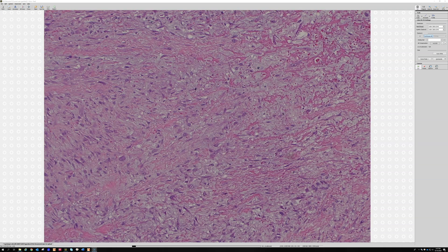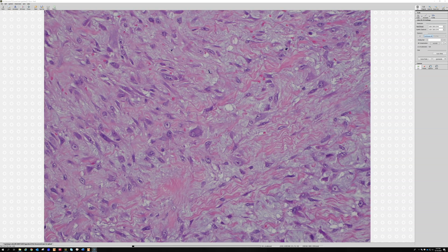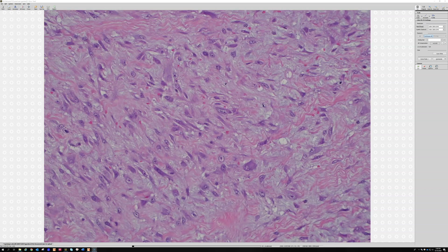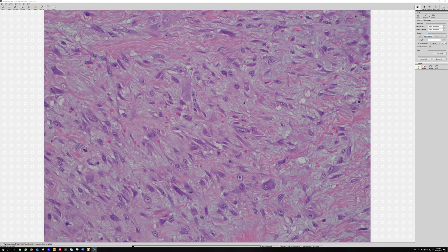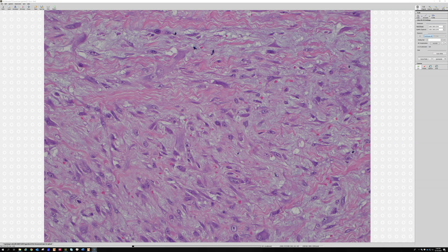But look at what these big nuclei look like — they look just like those ganglion-like cells from the last case. And look at the background cells: myofibroblasts with purple cytoplasm and spindle-to-stellate look. See how that cell is kind of a triangle shape — that's what stellate means. They're never a five-point star, always more like three-pointed triangles. That purple cytoplasm and triangle shape is very characteristic of myofibroblasts.